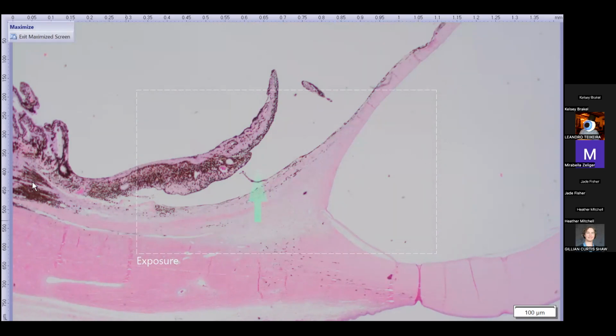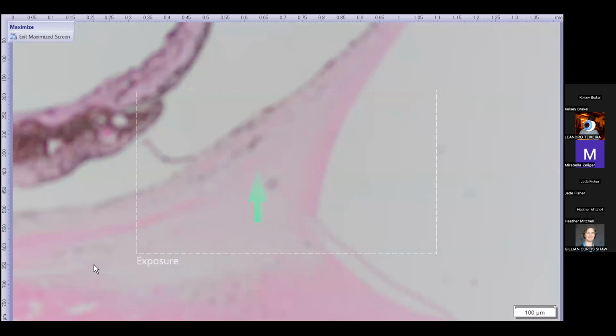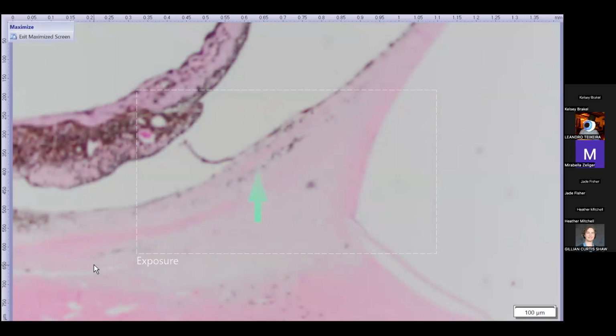So we have the iris here. We have the first ciliary body plica coming out here, and this pink tissue is dissecting into the supraciliary space or extending into there. And Descemet's membrane, we have one end here and another end there. So there's a peripheral rupture or break in Descemet's membrane, fibrous tissue that's crossing the anterior chamber like a membrane, and then it's into the supraciliary space. We can take a closer look at that to confirm everything that we just said.